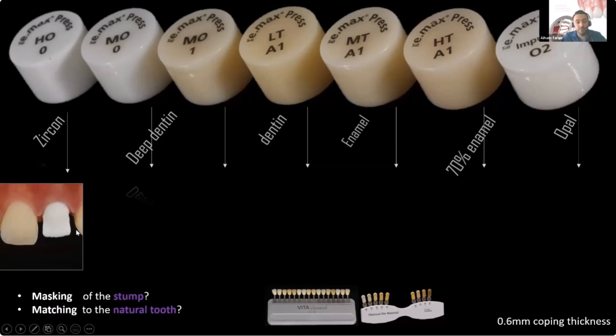Remember that all the copings here were pressed at a thickness of 0.6 — all of them are identically designed, milled in wax, and pressed. So we pressed the first coping out of HO zero, the high opacity ingot.